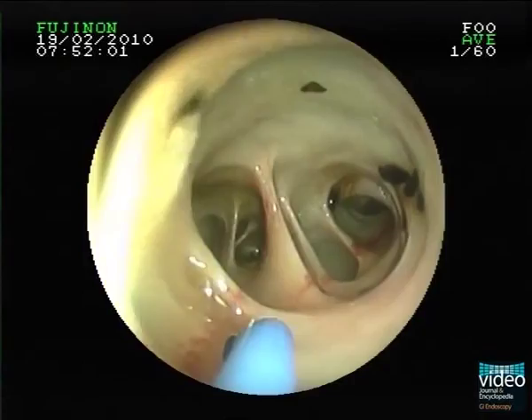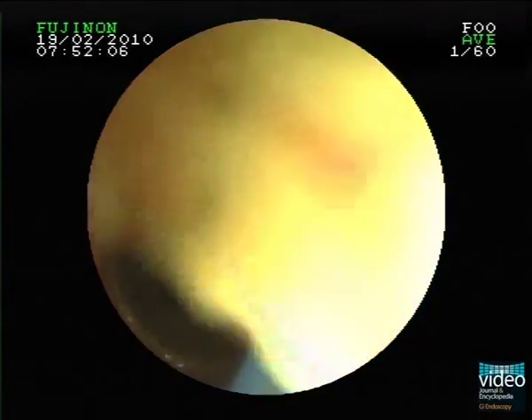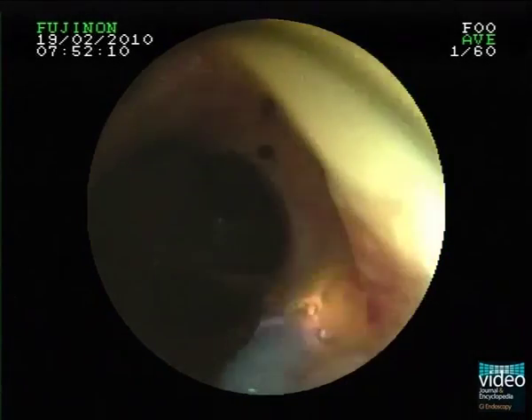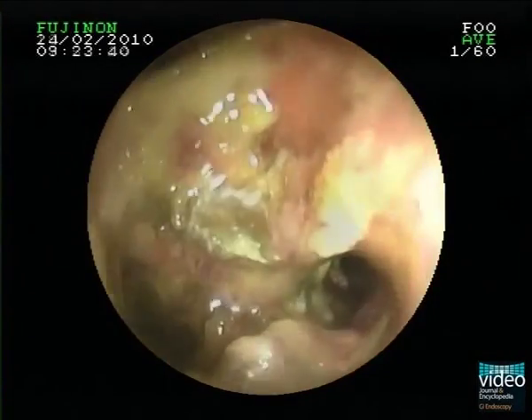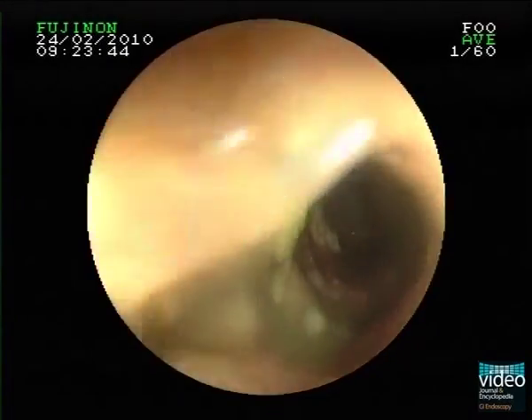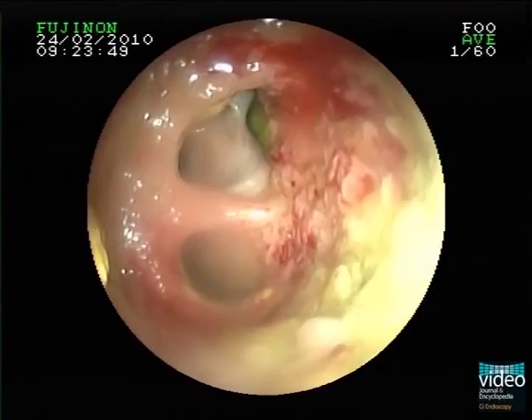We slowly withdraw the endoscope and here we find the proximal edge of the lesion. You can see that APC allows well-controlled ablation of the villous neoplasia. Keep in mind that during APC, critical amounts of gas and smoke are generated — we have to make sure that this gas is suctioned away in between APC applications.